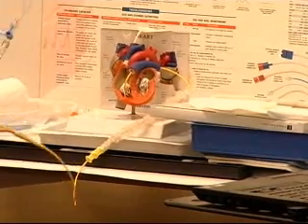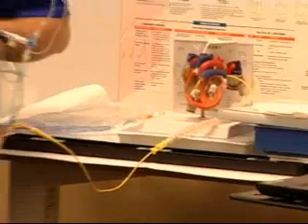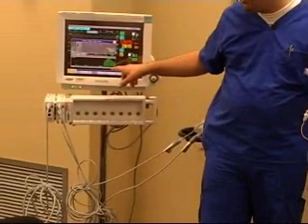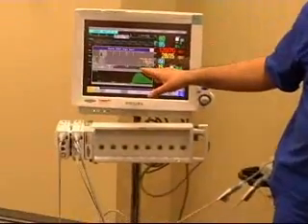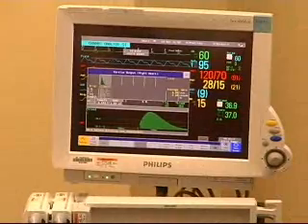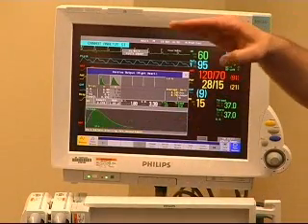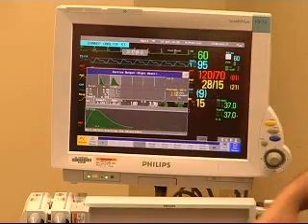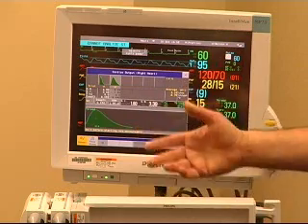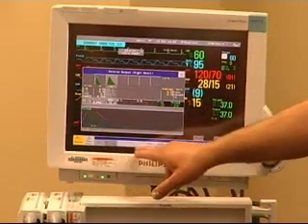This has several demo injects in it. Like I say, it's in demo land, so this one's maybe not as pretty a waveform. It wasn't quite as quick an up curve. And when the down curve comes back down very quickly, that means that you've got good cardiac output and that it's clearing it out, and you've got a great heart. So if it's going really slow, then you're most likely not dealing with a good situation. Our cardiac index on that, by the way, is 1.8. So it's pretty representative of what it looks like. There are several different examples in here.